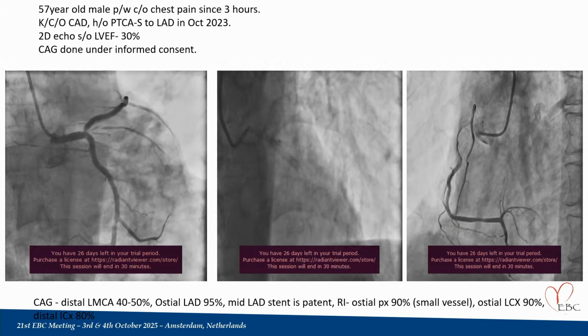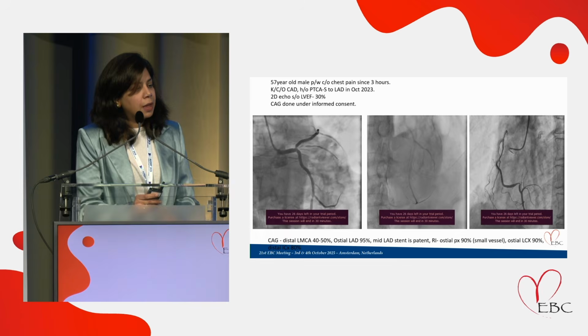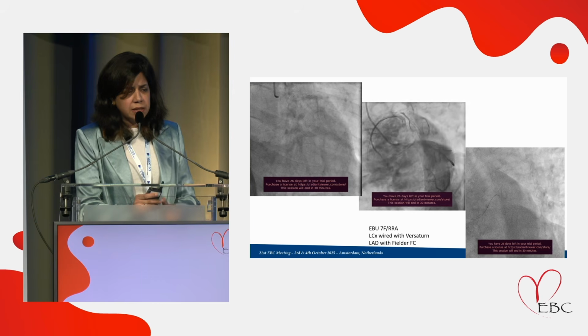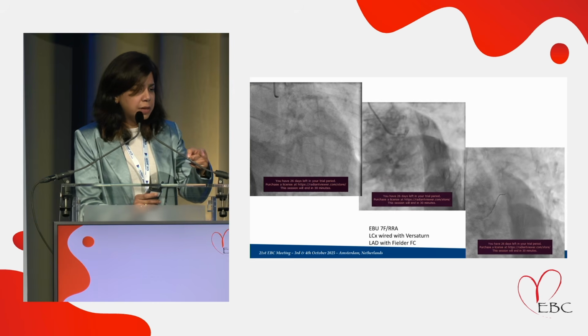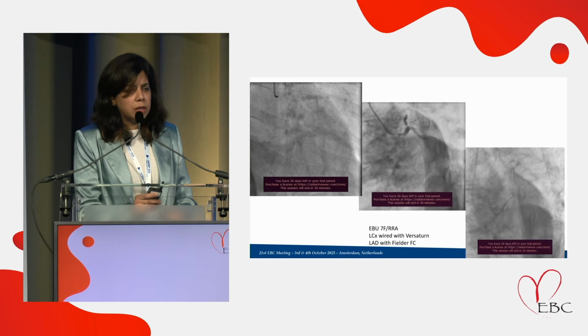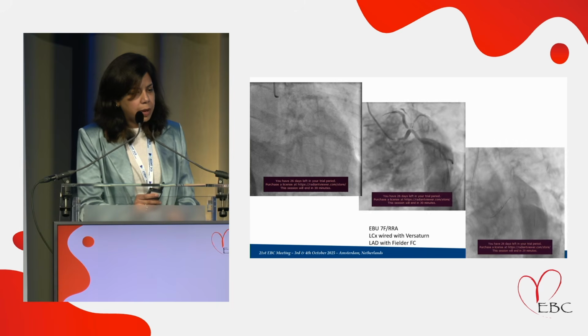But the stent was pulled back, maybe because of the POT, as discussed by Dr. Himanshu. So we wired both the LAD and circumflex, and in the second image, we can very well see the disease criticality into the ostia of both left main and into LAD and LCX. We wired both the branches.